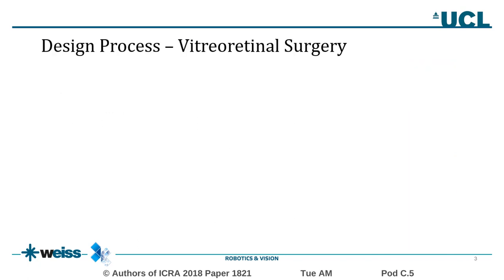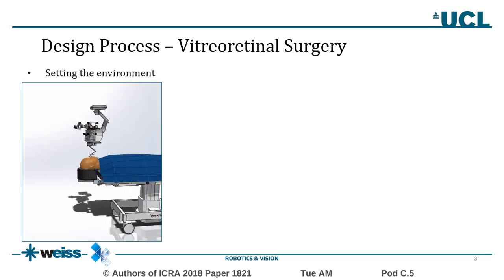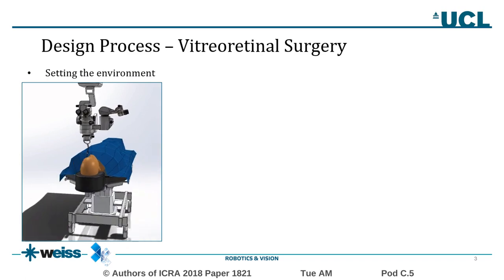Now, the next step of our work includes the application of the presented process for designing a robotic tool for retinal surgery. But before we move to the actual design of the robot, we consider the ergonomical constraints during a surgical procedure by setting the environment for retinal surgery using CAD models that we designed from scratch.